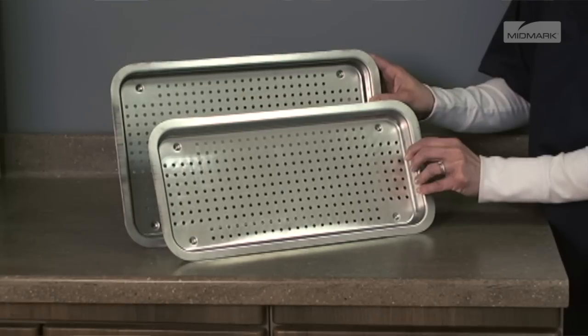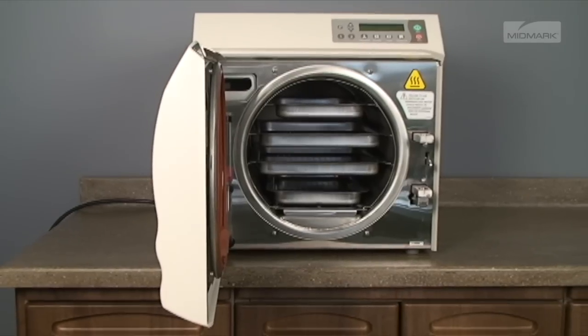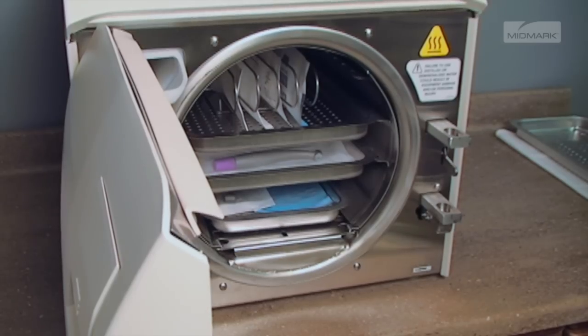Use only M9 or M11 trays in the appropriate sterilizer, as using other trays could restrict air and steam flow to items. Place jointed items, like forceps or pliers, in an open position. Handpieces and instruments must be single height loaded, not piled or stacked.